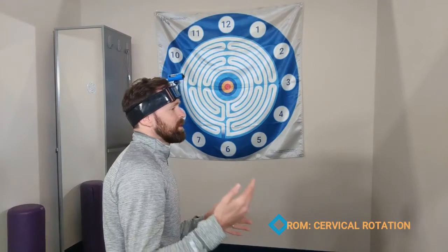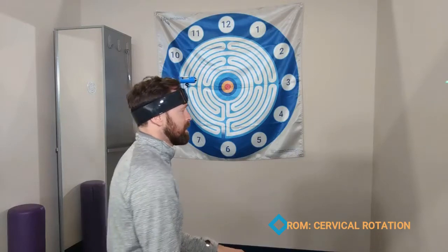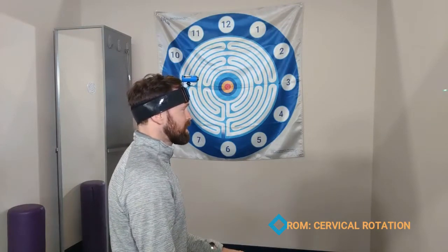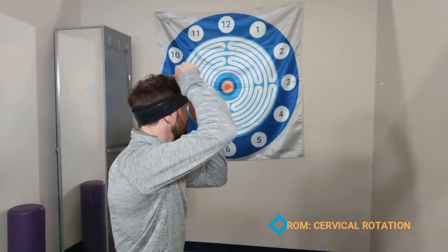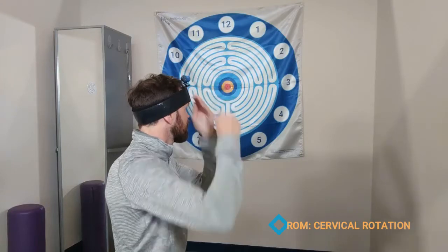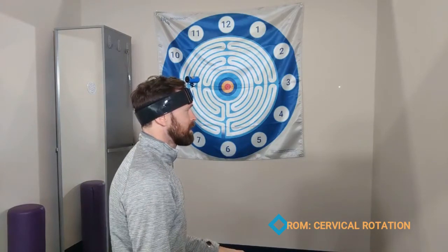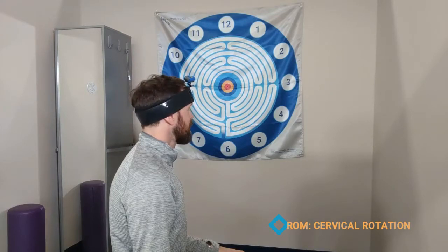If you want to test their max and then see if they can get past that, a good way might be with a chair — have them rotate fully in one direction. Let's say that's all they can get. I can then come in and bring this laser all the way to the center and then bring them out of that. Now they're really just trying to get to the center or beyond.